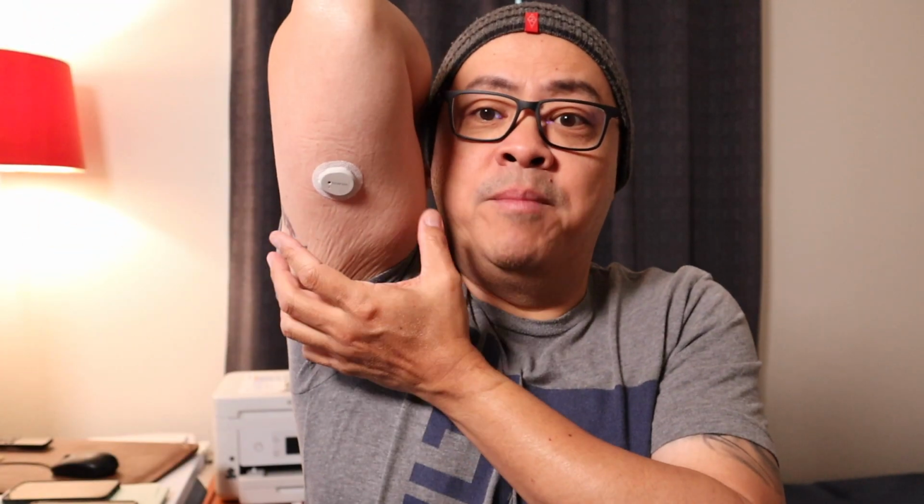1, 2, 3. I really didn't feel anything. So, uneventful. I was anticipating a little more pain, but no, it wasn't painful at all. What they also recommend is to go around the device with your fingers, so the adhesive is firmly in place.